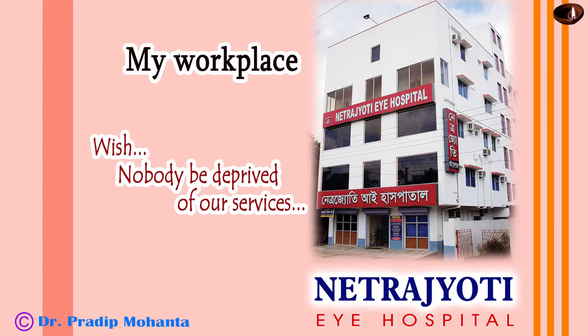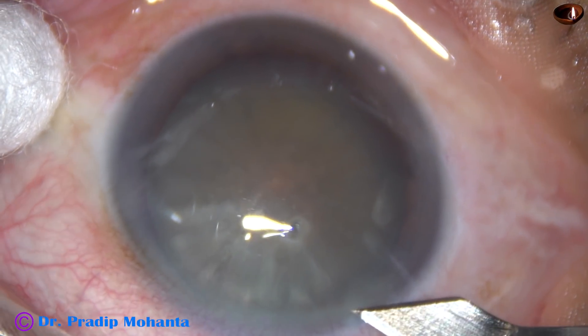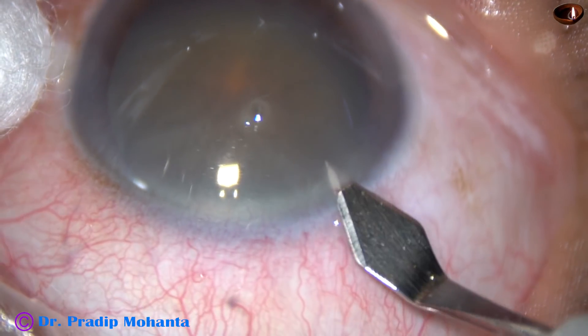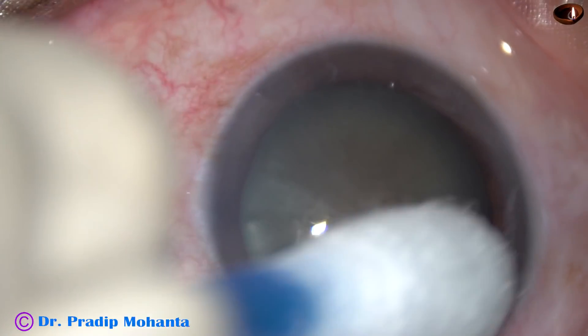Friends, welcome to my workplace at Ranaghat, West Bengal, India. This is a mature white pre-intumescent cataract. I have taken up this case for surgery. Let us observe the surgical steps.